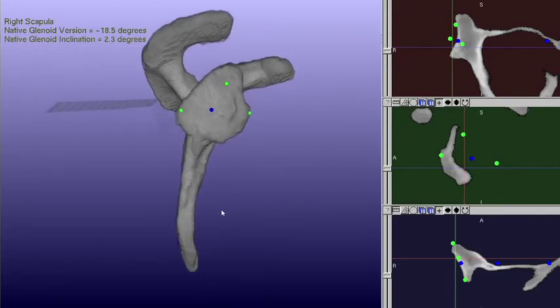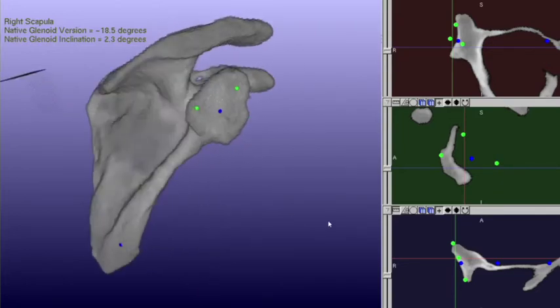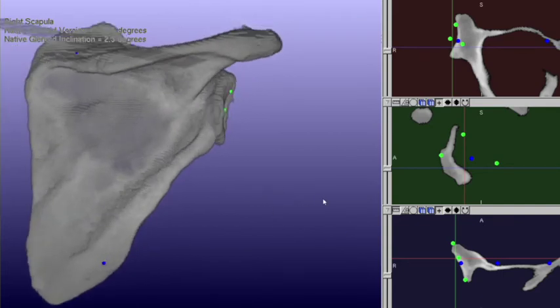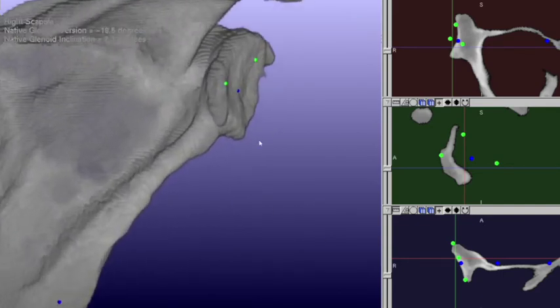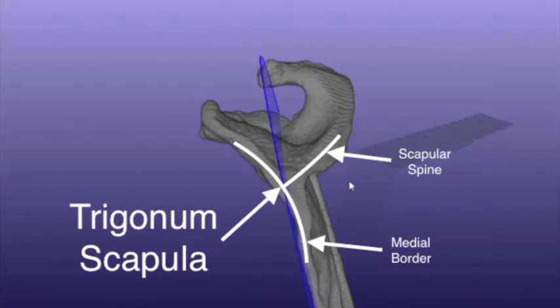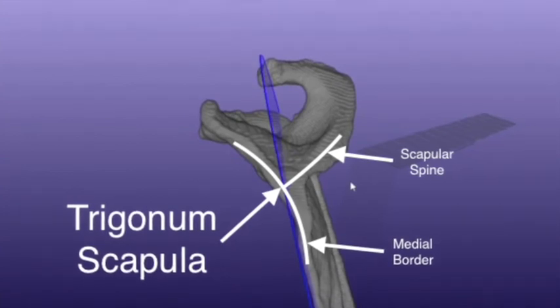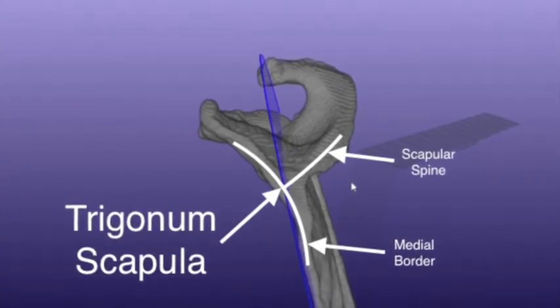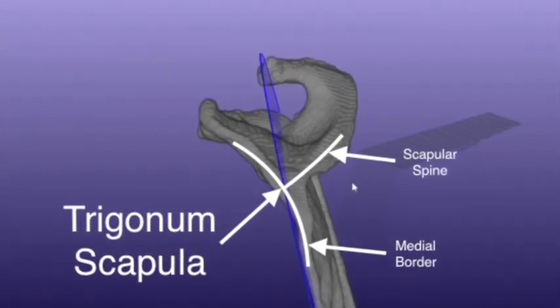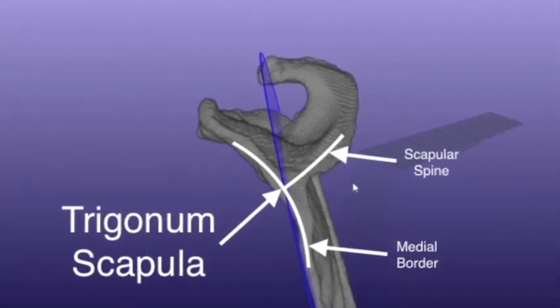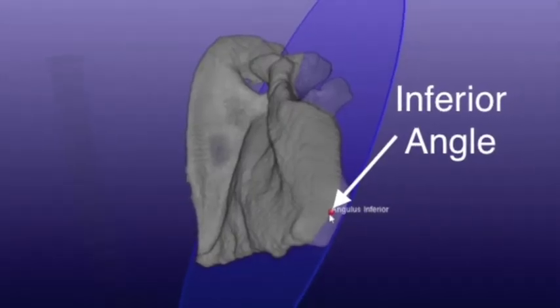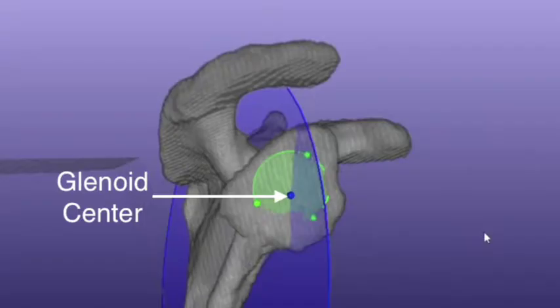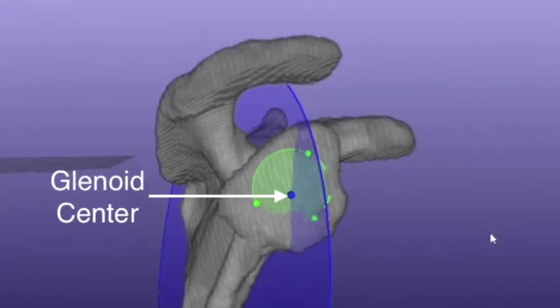Once we've converted the images to 3D, the first step is to define the plane of the scapular body. This is made by three points: the first is the trigonum scapula, which is the confluence of the scapular spine and scapular body; the second is the inferior angle; and the third is the center of the glenoid.